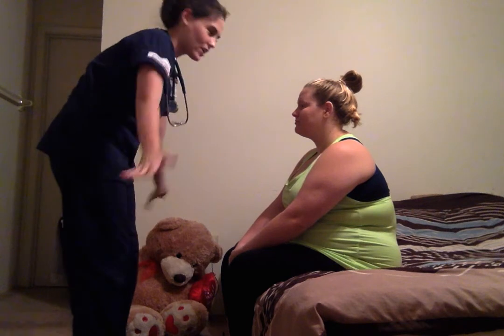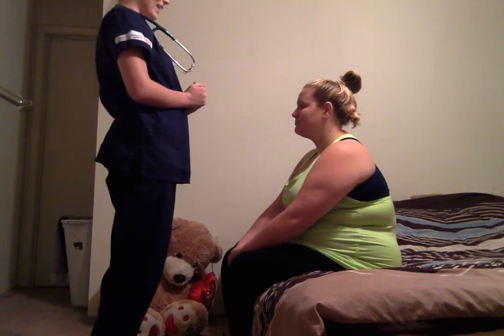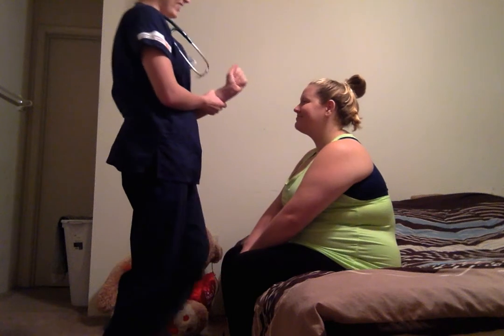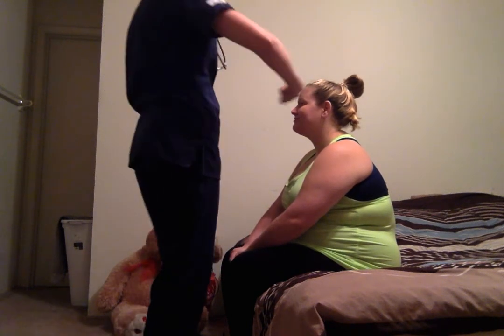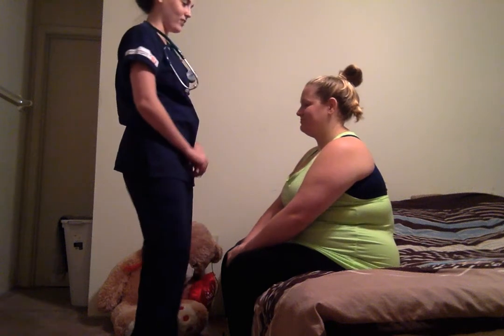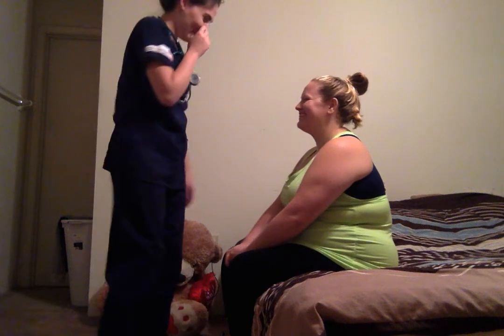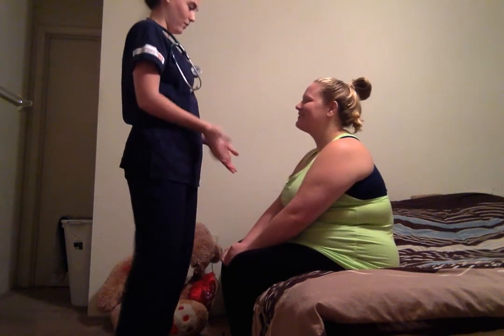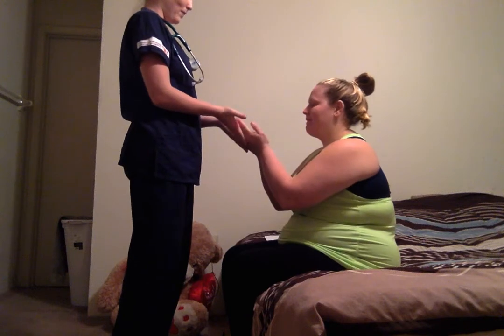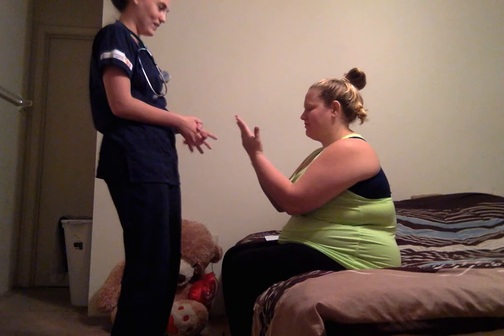And I'm going to just check her pupils now, and I'm going to shine my pretend light, and both of them contract at the same time on both sides. And I'm going to now check for accommodation, so if you could stare off and then look at my finger. Perfect. Your eyes accommodate. I'm going to give you the Rosenbaum test for near vision. You can just pretend.